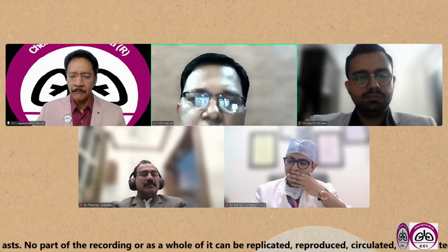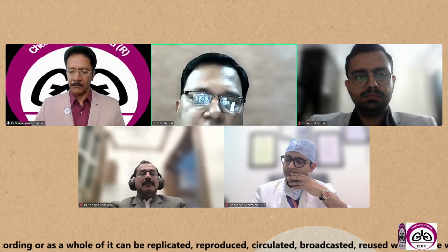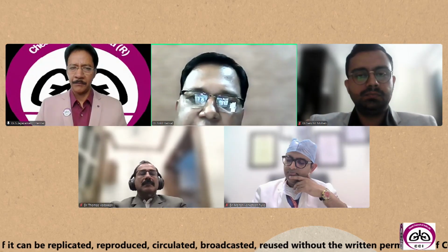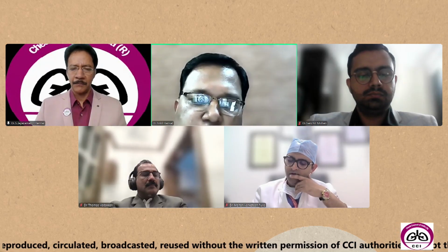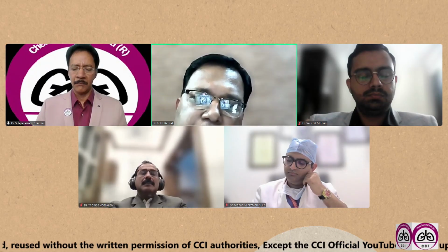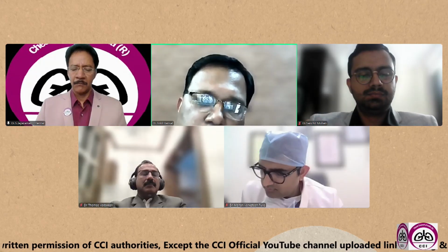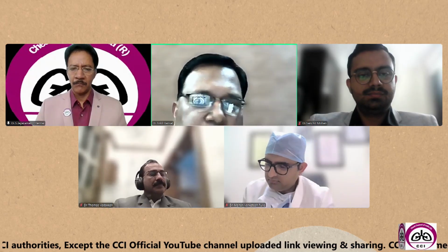So basically we can see how far the node is from the airway. We will see the esophagus. This is all important because the orientation will be set up. We will have an airway landmark, which will predict the carina shape and size and the right and left main bronchus orientation. We have a vascular landmark: we will see the pulmonary artery bifurcation, and the relative position of the aorta and the superior vena cava. Soft tissue landmarks will also be there. So this will completely set things up for us, so that when we do EBUS, it will guide us not only to the carina but also to the subsequent node, either higher up or lower down, which needs to be sampled.